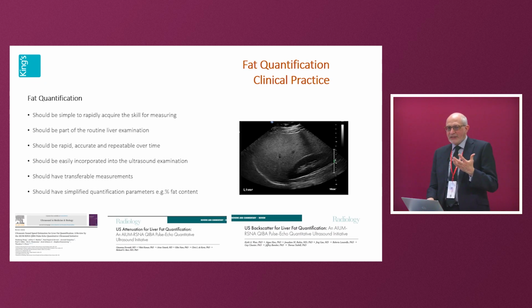So when you're doing fat quantification in clinical practice, what should you be able to do? Well, it should be simple to use. So it's one button, you get your measurements, okay? At the moment, you're doing 3-5 measurements, and this takes 3 or 4 minutes to do. But if you're doing a clinic where you're examining 3 billion patients, you don't want that 3 or 4 minutes. This expands to greater than your lifespan. So you want something that's very rapid.